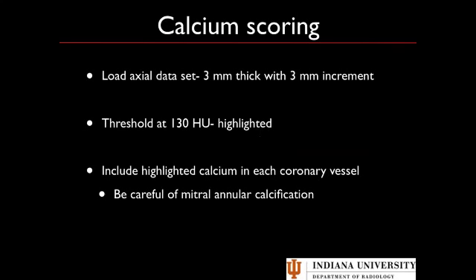Let's move into calcium scoring. You're going to acquire images that are three millimeters thick with three millimeter increments — that's left over from EBCT, the way EBCT was obtained. We load that axial dataset, and the software will highlight anything with a Hounsfield unit greater than 130. Then we find those highlighted areas within each coronary vessel and label which vessel the calcium is in.